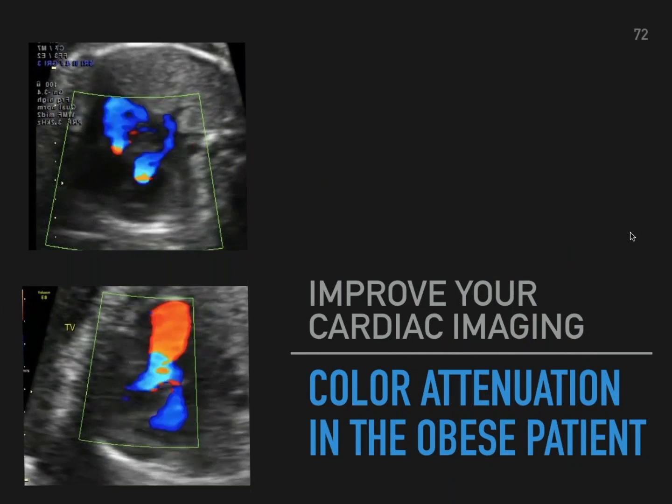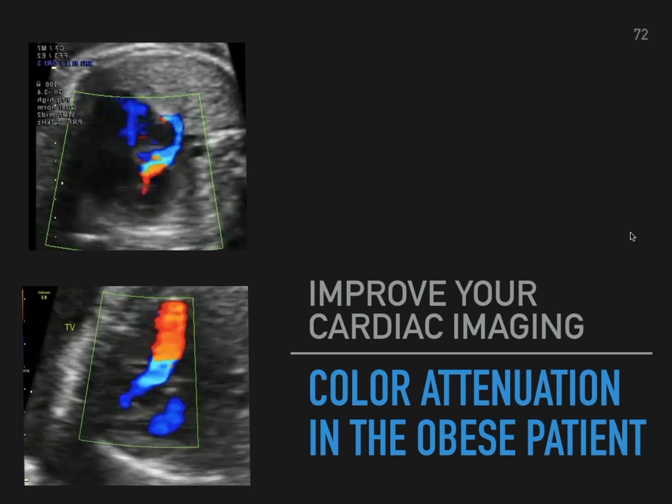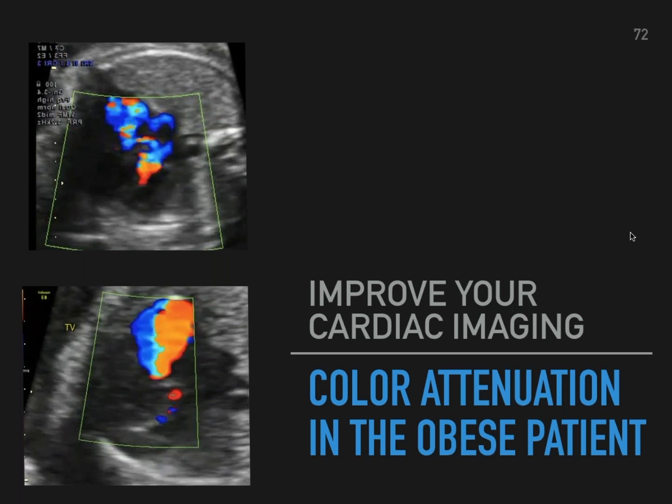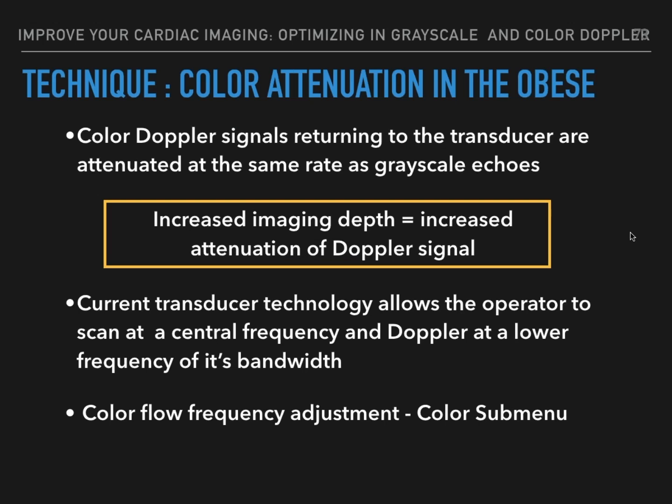Another excellent technique with color Doppler, with tips on attenuation in the obese patient. Color Doppler, as we all know, the signals returning to the transducer are attenuated at the same rate as grayscale echoes. So increased imaging depth is equal to increased attenuation of Doppler signal.